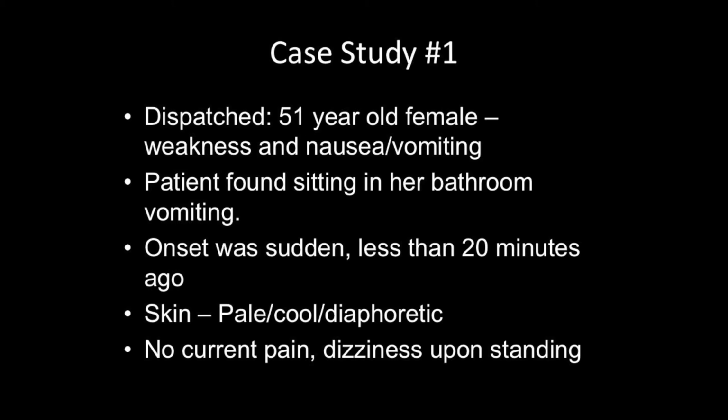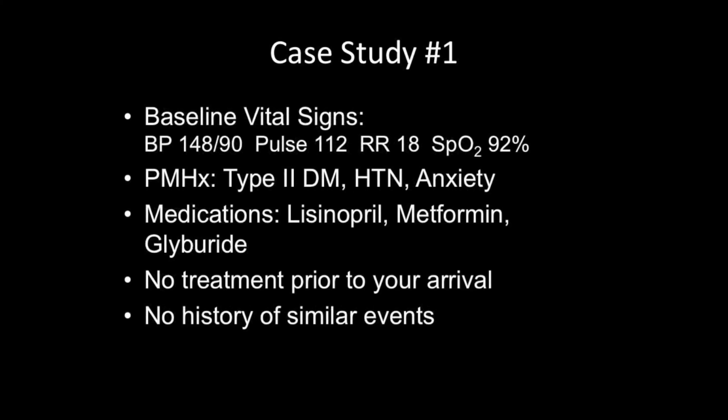So she's not sick for a long period of time, but it just suddenly came on less than 20 minutes ago. She's pale, diaphoretic, and she doesn't have any pain, but when she stands up, she has dizziness, right? That's probably not good either, right? Okay. So these are her baseline vital signs.